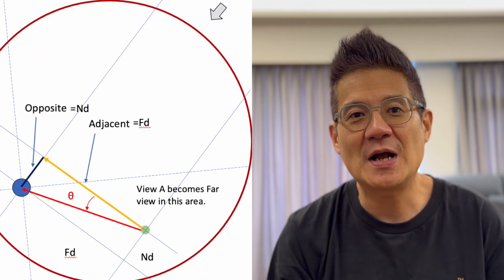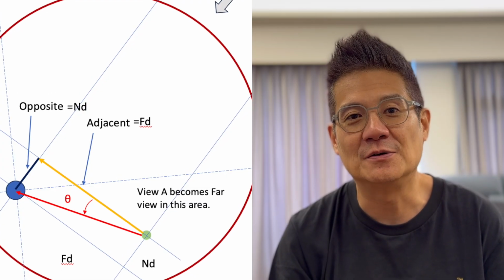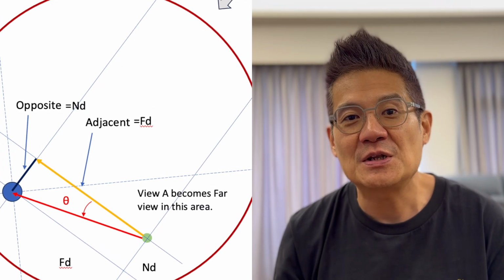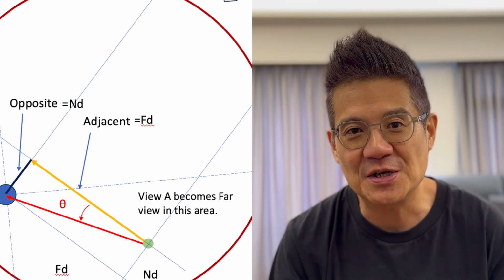This 2 ratio actually corresponds to the opposite and the adjacent of a right angle triangle, and the degree that you have to turn by this ratio is expressed by the term tangent theta. So here I am figuring out how I can turn a wire with a torque 14 degrees, which is about 2 minutes on the clock face. And I'm even thinking about designing a torque with markers so you can turn and know how far you've turned.